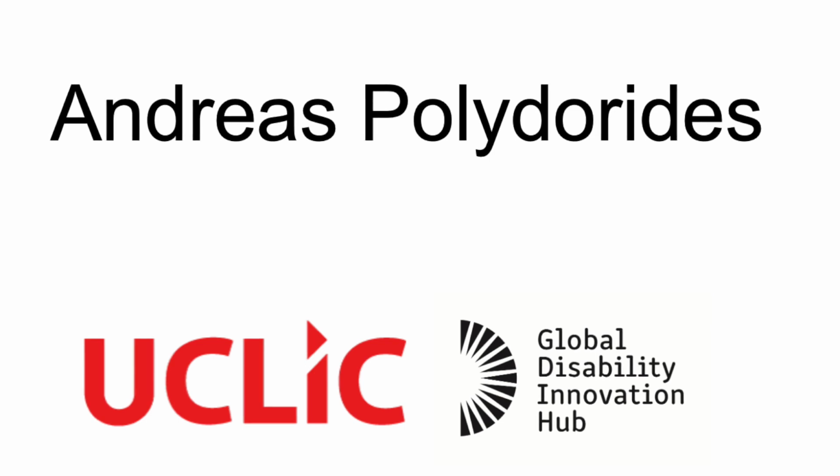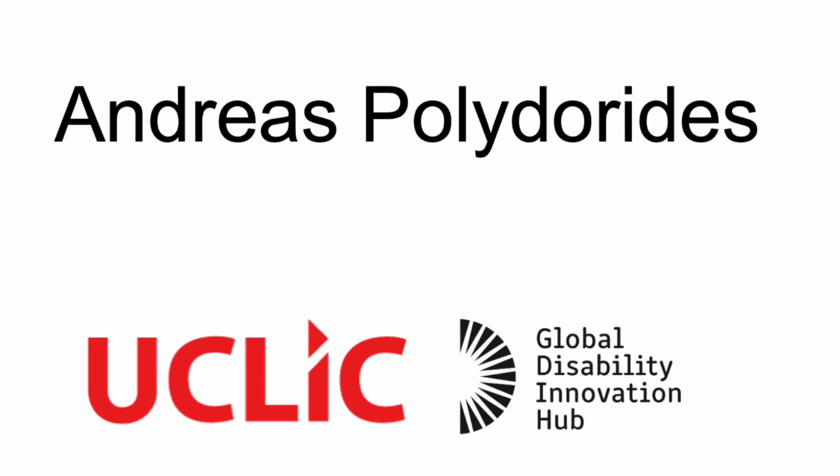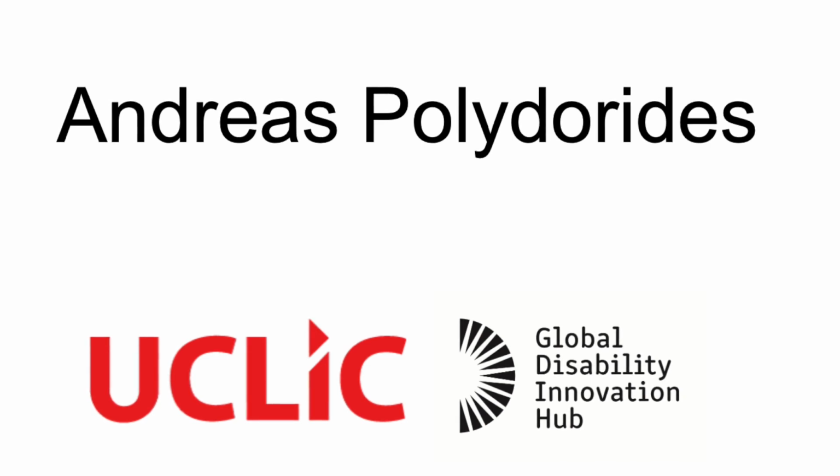I will be demonstrating 3 different open-source methods of producing highly customizable wheelchair cushions using 3D printing. This is all in an attempt to enable a larger proportion of the wheelchair population to have access to personalized pressure relief. This can be done through pressure maps, or if that is not attainable, through a little creative work. We print our cushions with 40D TPU and 83A TPE, but as with most open source projects, we are sure once more people start printing their cushions, we'll see a wider diversity of materials and methods.